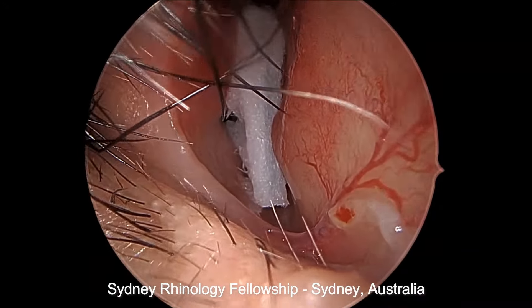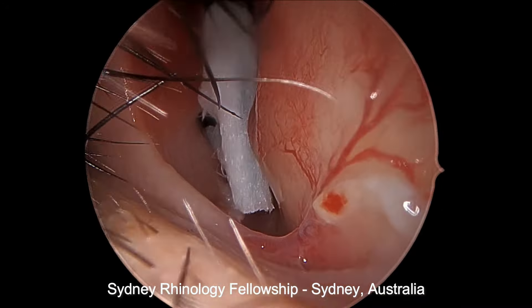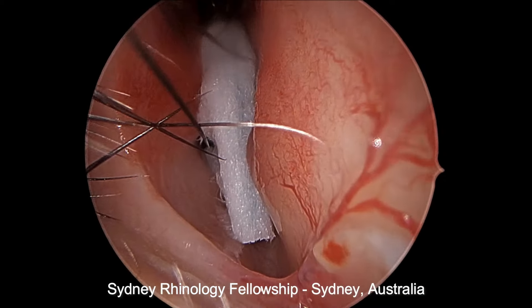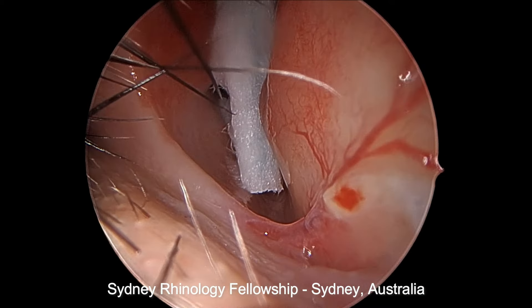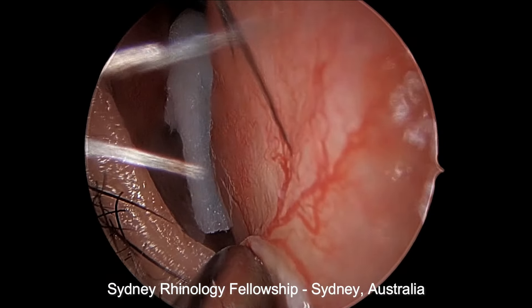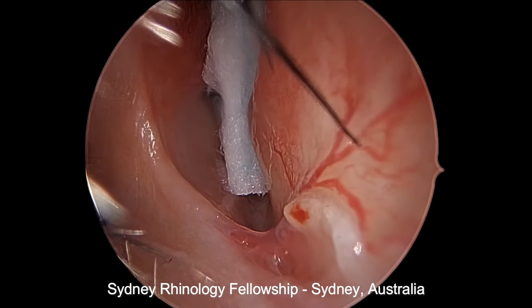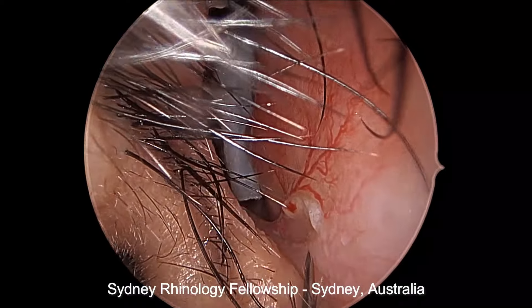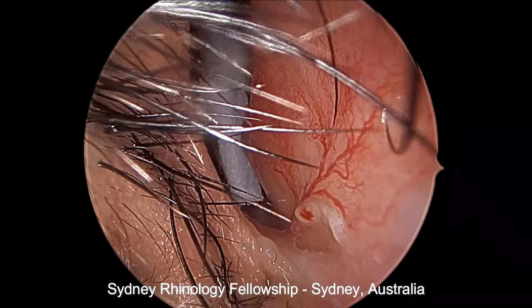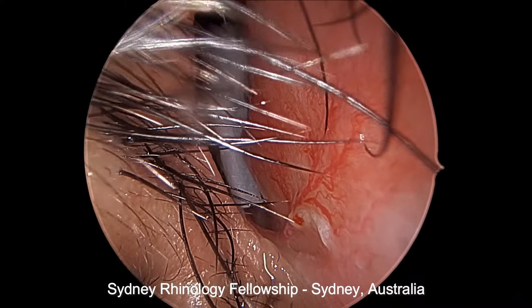Welcome to this short video about managing telangiectasia in the nose. Here on the right hand side, there is a large telangiectasia extending from the floor of the nose onto the nasal septum. This has been the cause of recurrent epistaxis for a patient, and it can be managed either under a short anaesthetic or under local anaesthetic.